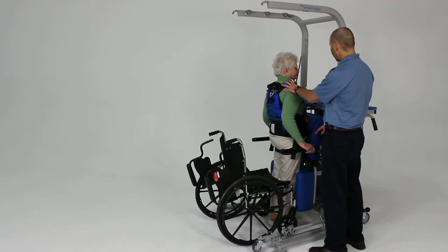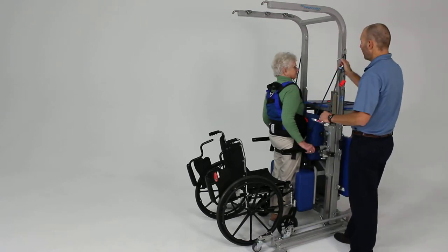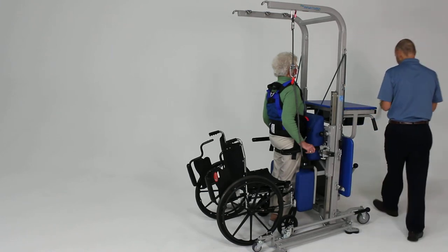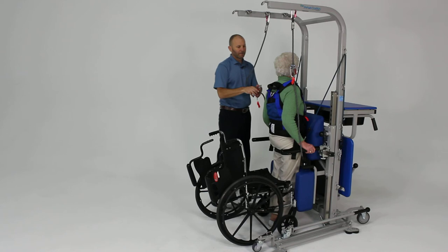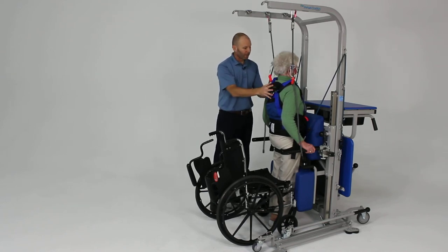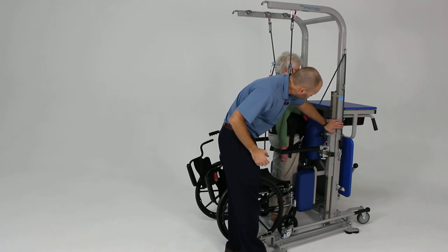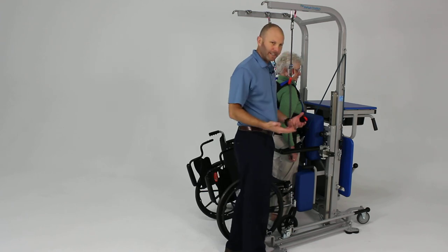We can also add some support for the upper body at this point. We've got our safety lines here, and we can add those to provide upper body support as needed, just taking up the slack in the rope. There are also additional straps that can be added to the D-rings and connected to the unit to provide a more stable anchoring of the pelvis and more of a standing-type frame effect.